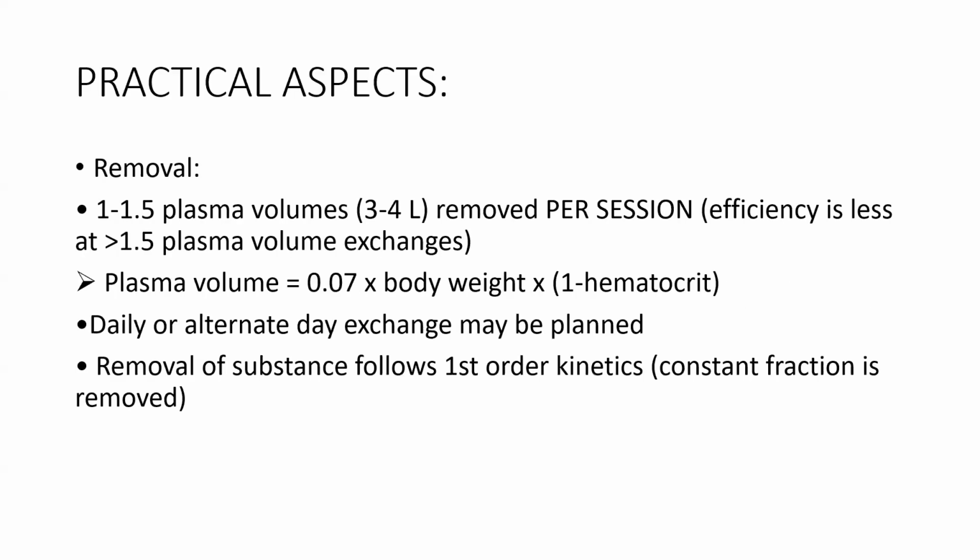Now we'll talk about practical aspects. As far as removal is concerned, we should remove at least 1 to 1.5 times the plasma volume. Now, how are we supposed to calculate this plasma volume? Plasma volume is equal to 0.07 into body weight into 1 minus hematocrit. So, this plasma volume should be removed either daily or on alternate days.